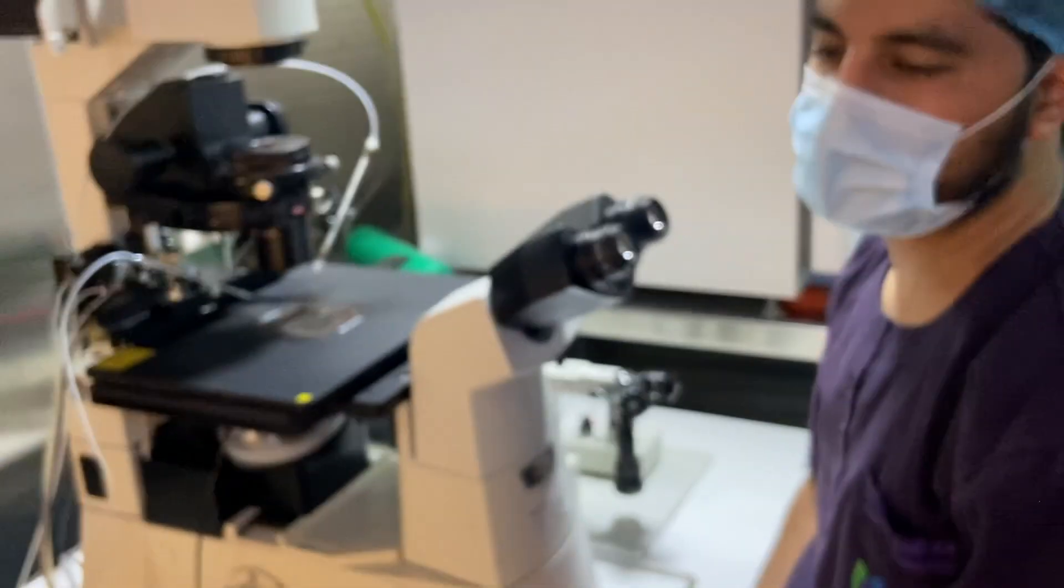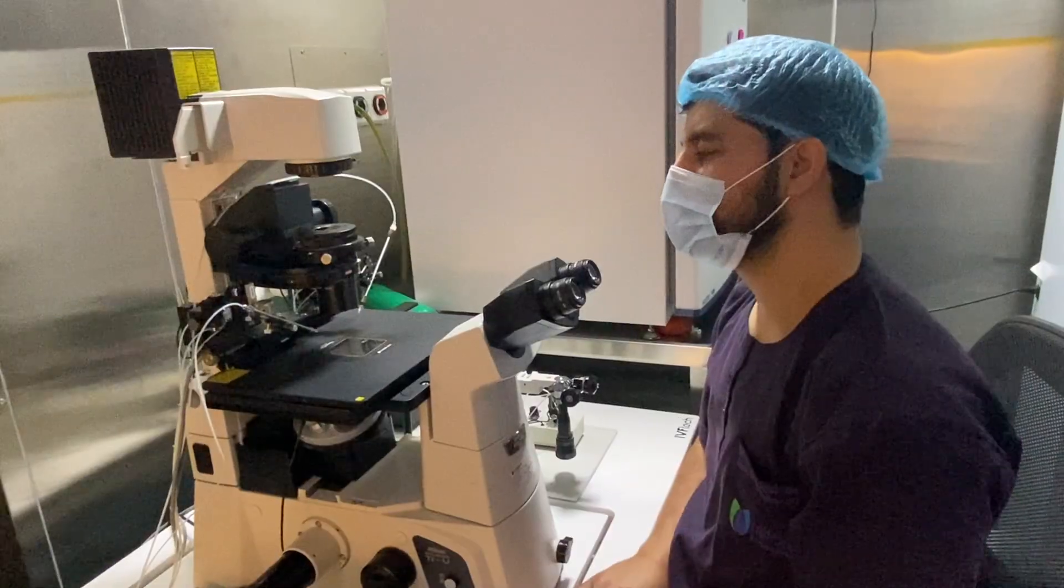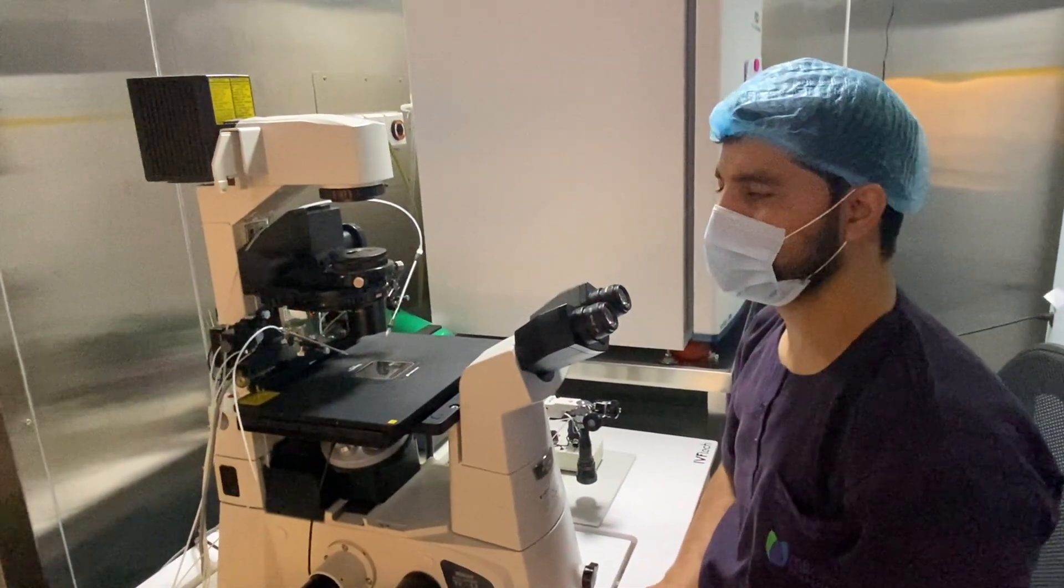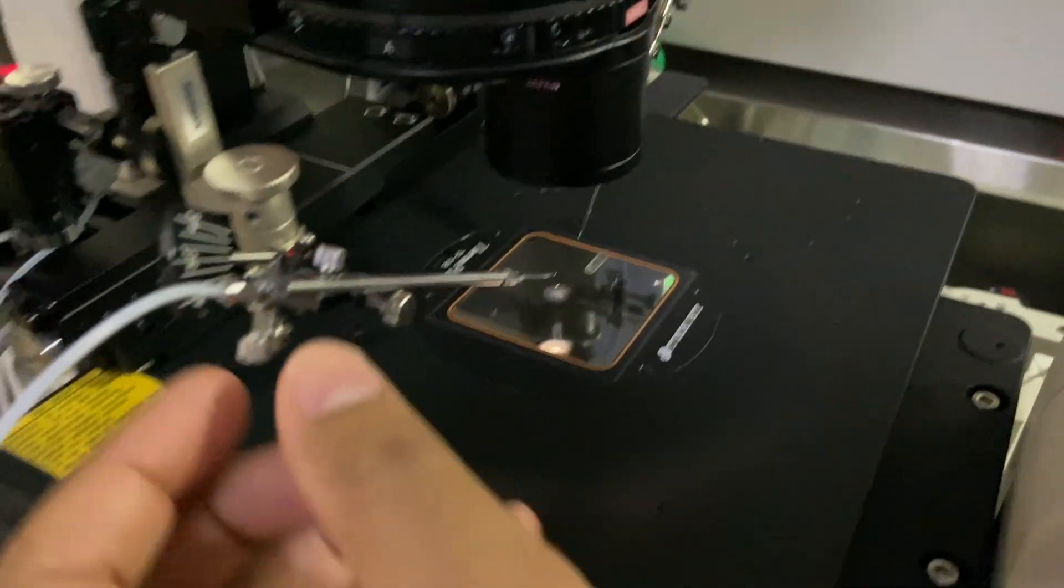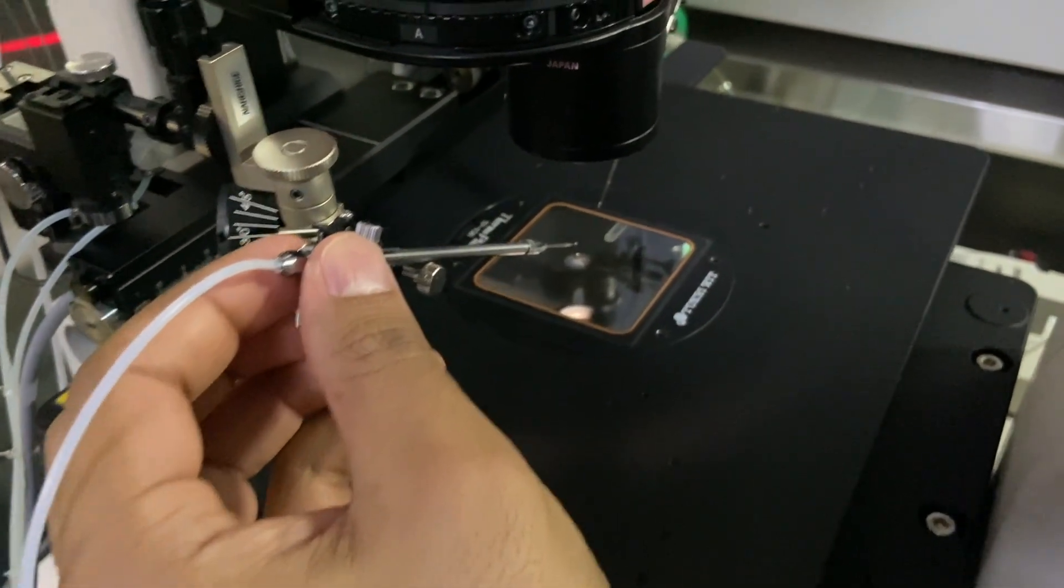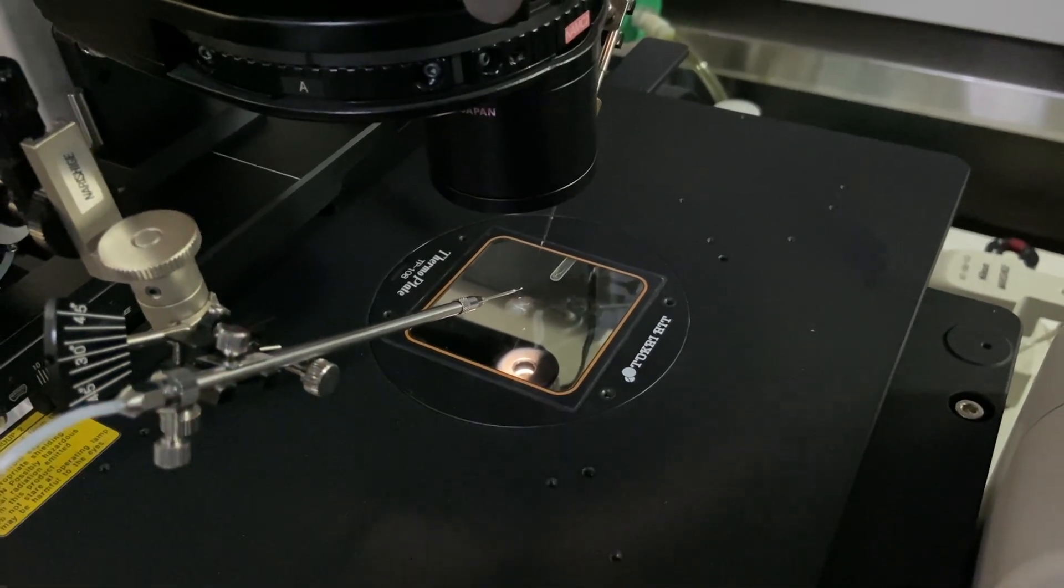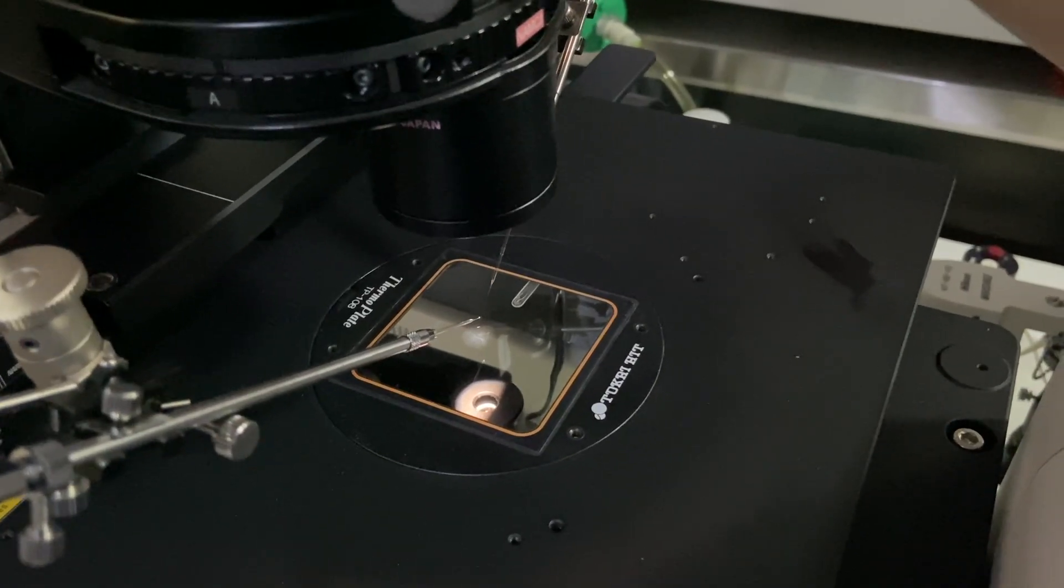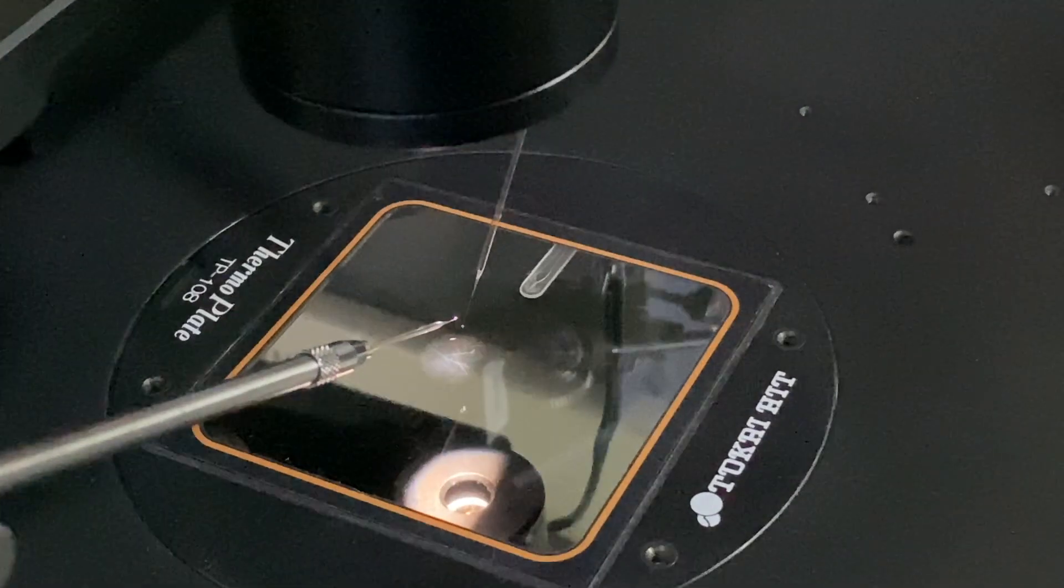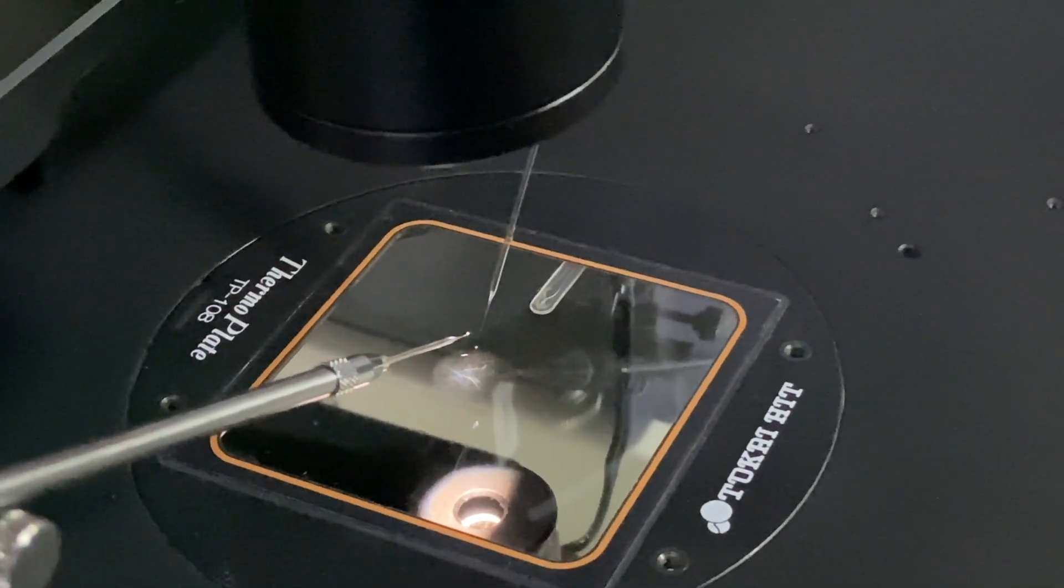The next thing will be to take the injecting and the holding needle and then use them properly. Thank you. So next thing is to bring these needles. This is holding needle towards the light. You can see the tip is shining. Similarly, this injecting needle also to bring it towards close to the light. You can now see the tip is shining.